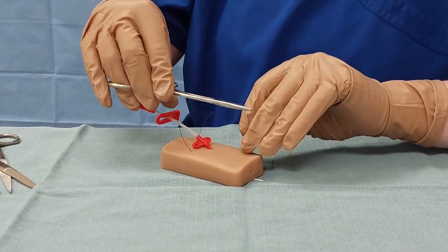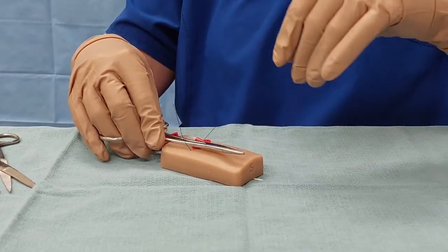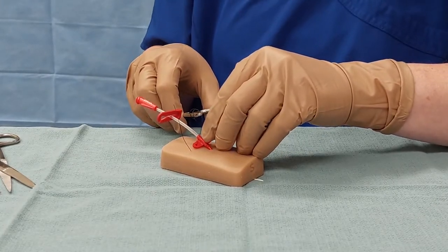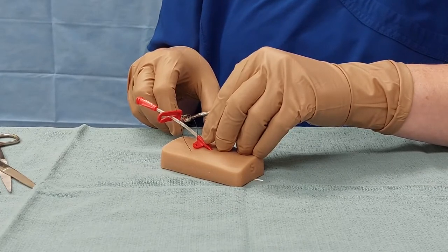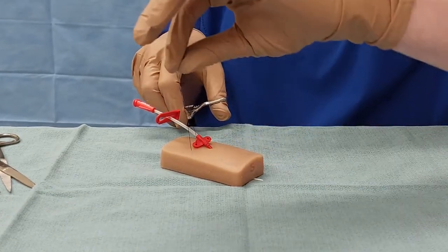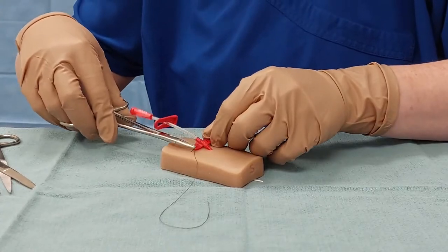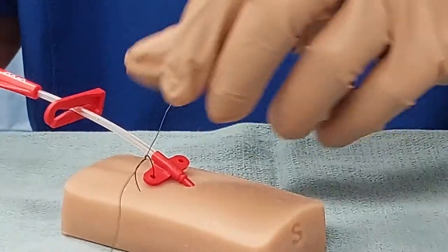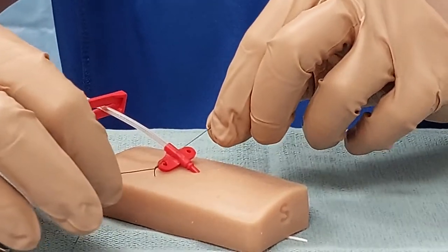Let's tie our knots. I'm going to put my needle drivers in the middle over top of where my knot is going to be, so I have thread coming out on each side, and I'm going to do my wraps. I'll do two, one, one, and one. You can also do three, two, and one — as long as the number of wraps is in descending order. I'm going to grab onto the tail and pull that through. What I'm looking for is a nice loop, not all twisted. I can put my driver in here and spread it out, with all of my twists on top, then pull down nice and gentle so that it's even.